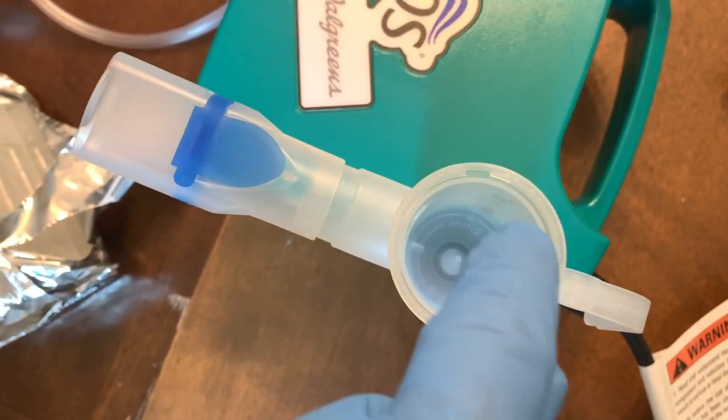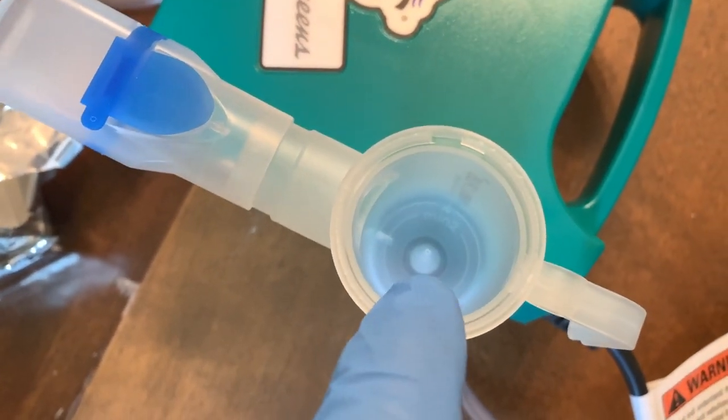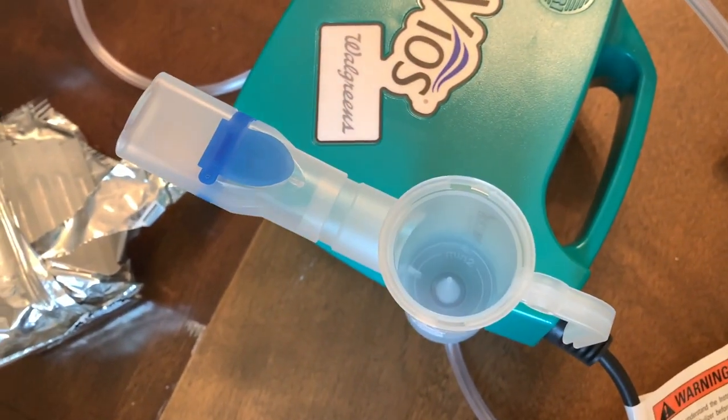Then we're going to put our medicine in. Medicine goes down right there, and it goes all the way around. See that big cone that comes up? That's where the airflow comes through, and then it turns it into a mist, and then you pull it right through here and breathe it. And that's pretty much how it works — it's pretty simple.